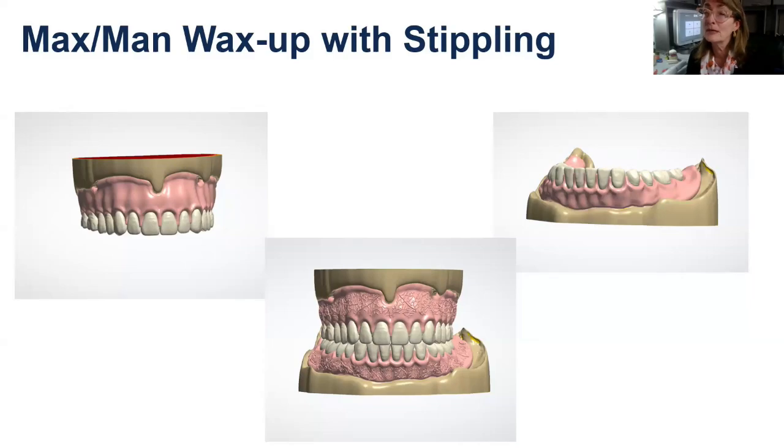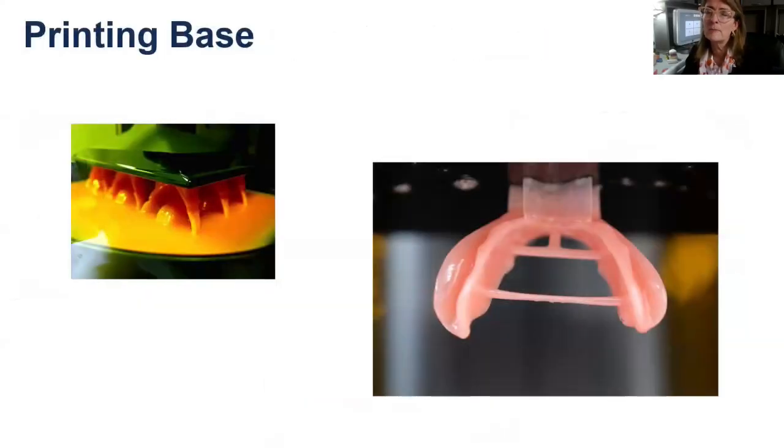I wonder what she had before, because I was not there on the appointment before. And sure enough, she had a smooth denture, and we ended up redoing it as a smooth instead of festooned and stippled. And she was much happier with the smooth denture. So I'd just like to share that as a pearl for you to think of when communicating with the lab about your own patients. So let's talk a little bit about what that printing of a denture looks like. So this is printing of the base itself.